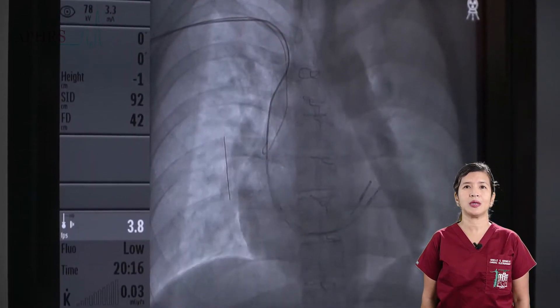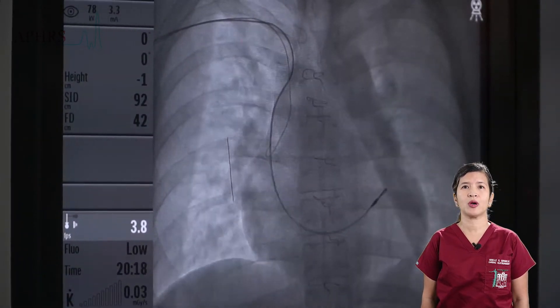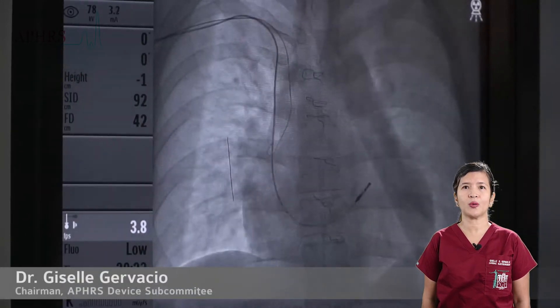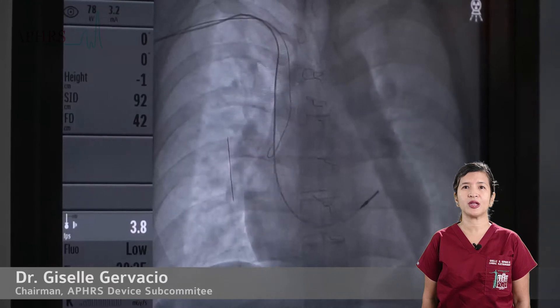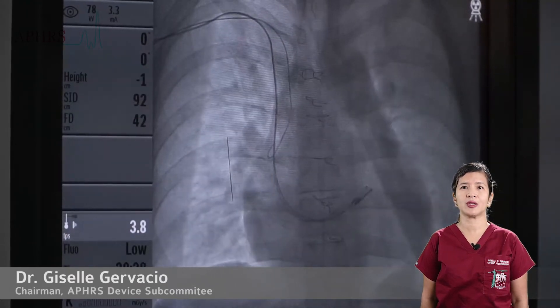Once the lead is in the RVOT, it is slowly dropped down to the level of the upper septum of the right ventricle. A counterclockwise torque is applied to the lead to try to position the tip at the region of the His bundle.